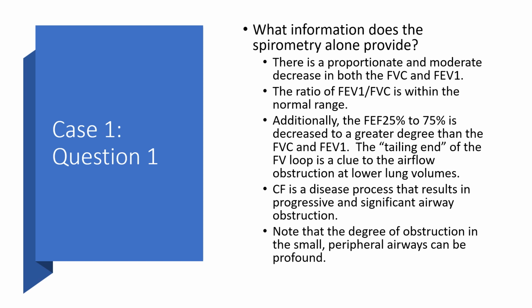So what does this all mean? There were a lot of graphics, a lot of interpretation, and a lot of numbers in the preceding slide. Let's try to boil it down. Interpreting pulmonary function tests requires not just reviewing academic material and textbooks, but actually doing it, and reviewing videos like this and the many other fine videos out there on the performance and interpretation of pulmonary function tests. So let's take a look at this question regarding this case.